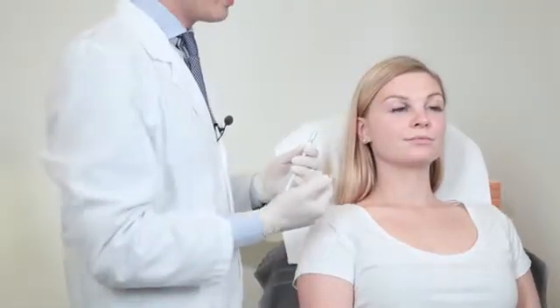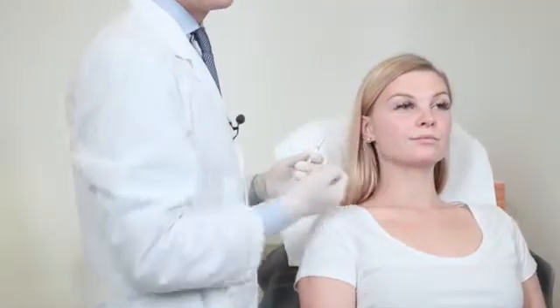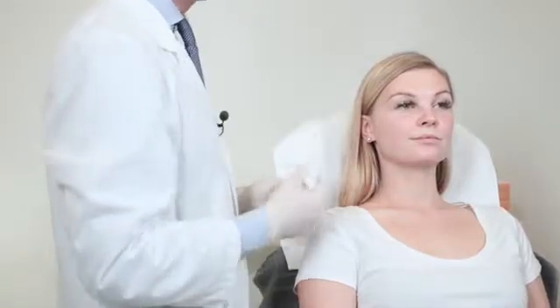This is Cassandra's first aesthetic treatment. She's looking for natural enhancement of the lips and cheeks. Cassandra is a young patient with good skin quality, firmness and elasticity. She also has excellent tissue coverage and shows only fine dry lines around the eyes and some mimic lines in her forehead. No static wrinkles so far.